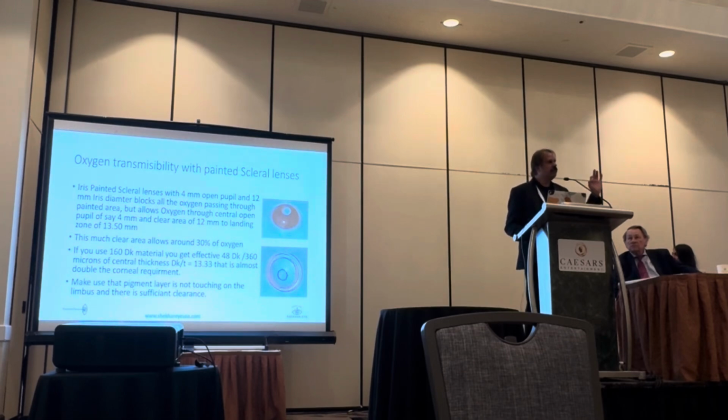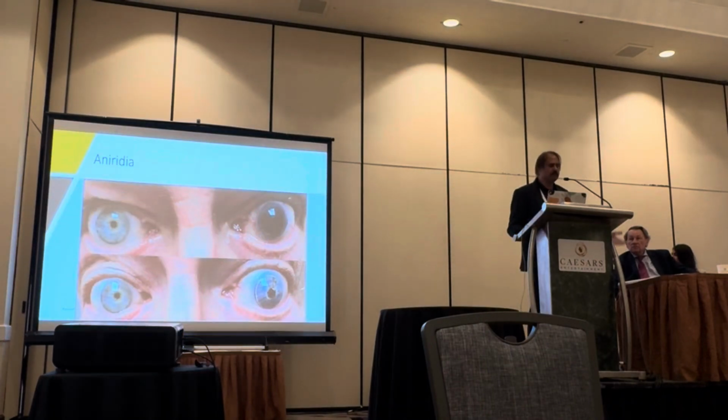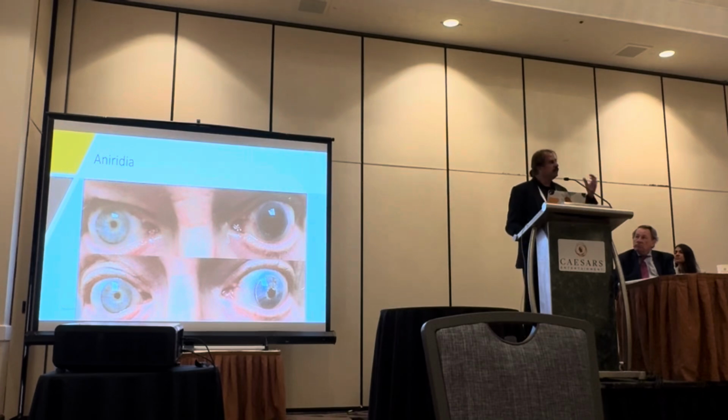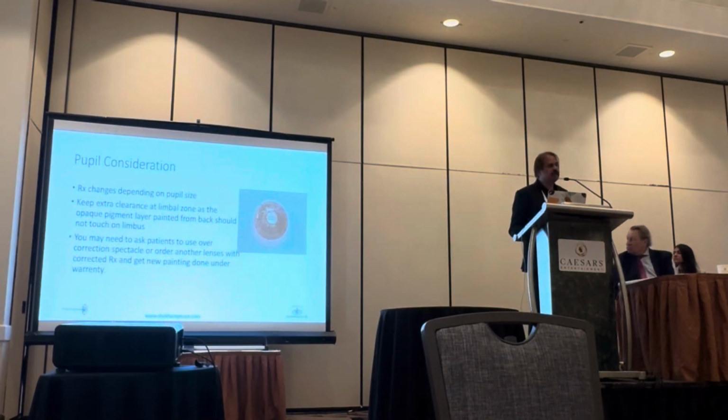But the central window of 4 millimeter and the peripheral zone from 12 millimeter of iris to landing zone of about say 13.5, those two areas are still transparent and allow the oxygen to pass through that material, which reduces almost 70% of oxygen. So you get only 30% of effective oxygen, but still it is double the requirement of the cornea. The effect of the cosmesis is not always matching because the reflection of the light is from a different meridian, but patients are happy because of the controlled light which is entering the eye from this artificial pupil that we created.